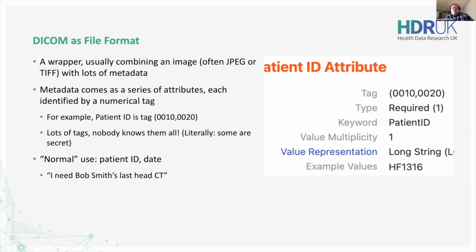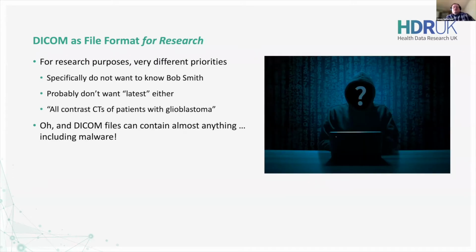Unfortunately, it's pretty much the opposite of what we want in research. We specifically don't want, even if we have Bob Smith's scan, we specifically don't want to know that it is Bob Smith's, or his date of birth, or his address, or any of the other things that a hospital would normally keep track of for a patient. We flip from regarding them as patients to anonymized subjects considered within a larger cohort.